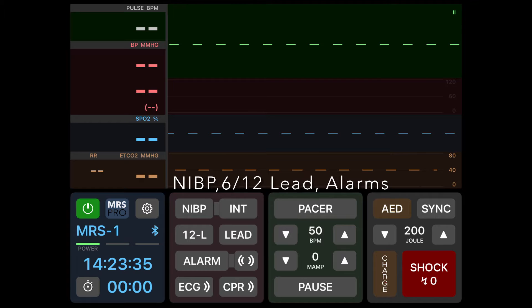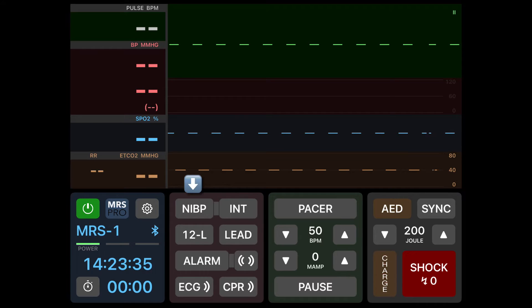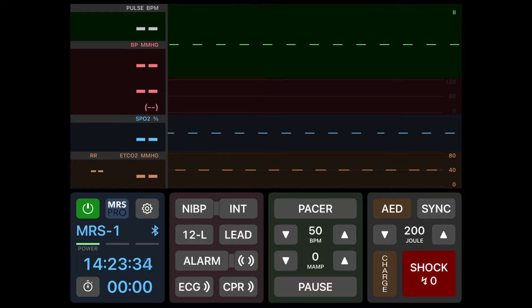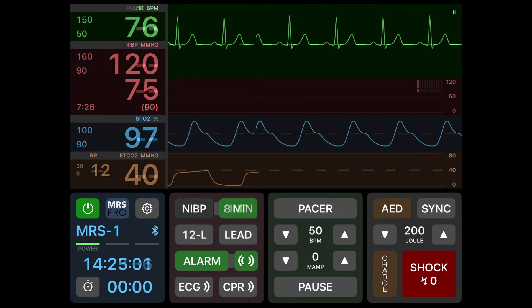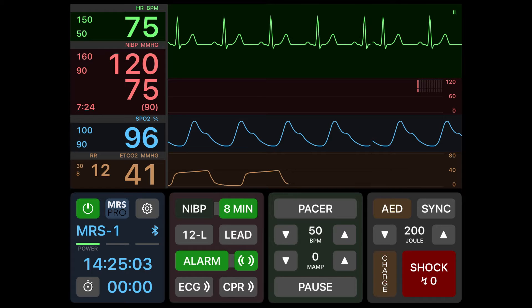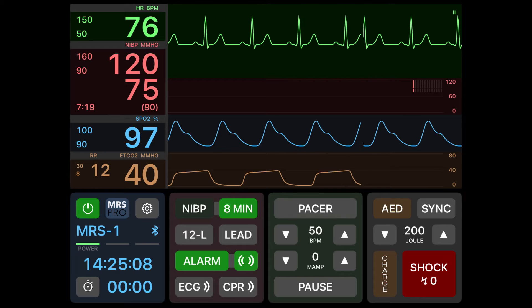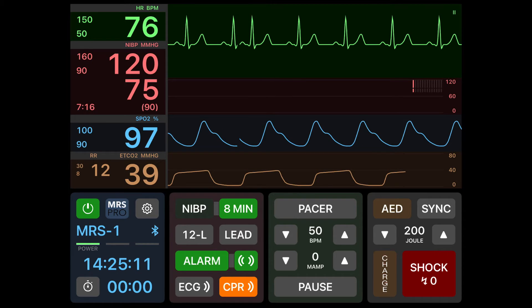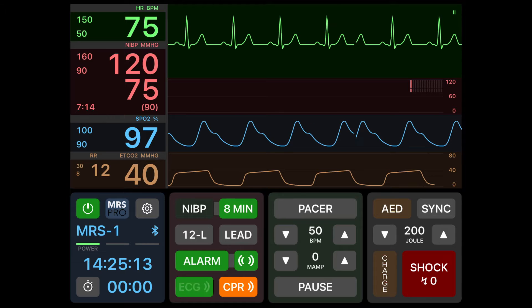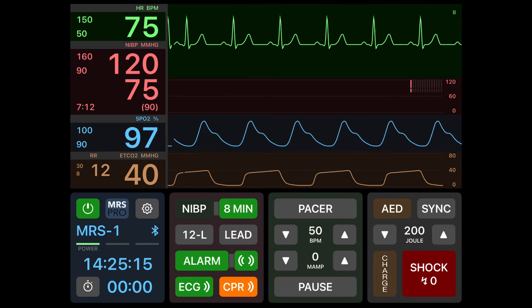To the right of this section is where blood pressures and intermittent blood pressures can be taken at intervals of two minutes, four minutes, and eight minutes. You can also toggle between the leads as well as take 12-lead EKGs for the rhythm showing on the monitor. There are alarms that can be added to the scenario that allow the student to hear a metronome for CPR as well as an alarm for the EKG.